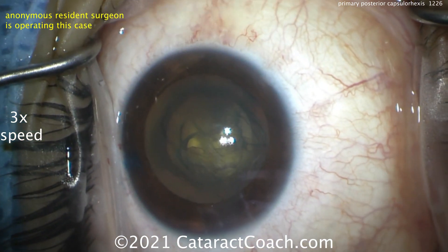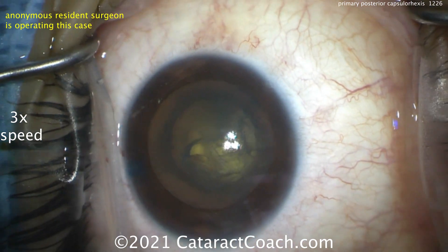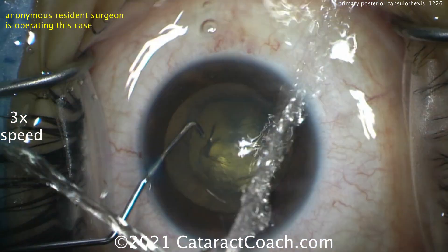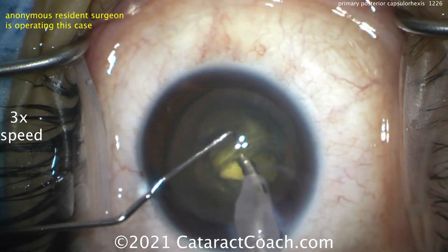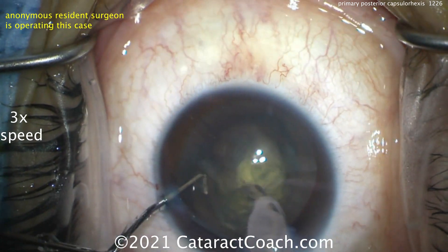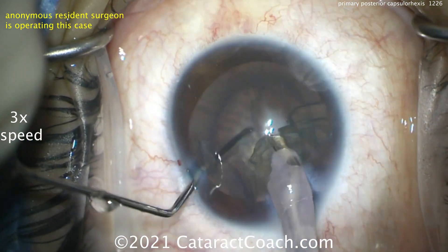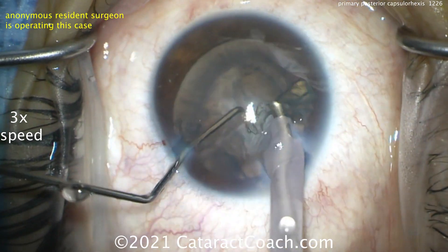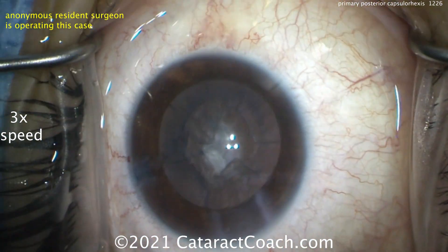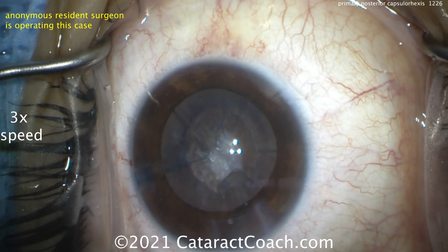Hydrodissection — you want to get this nucleus up out of the bag. It's very soft. If you can't get it up completely, it looks like a phaco probe going in, but there's nothing to chop — you're just going to aspirate and bring it up. You don't even need ultrasonic energy, so don't go into position 3. Take down as much of the nucleus as you can, then switch to the IA probe early — we're going to have a lot more control with it.